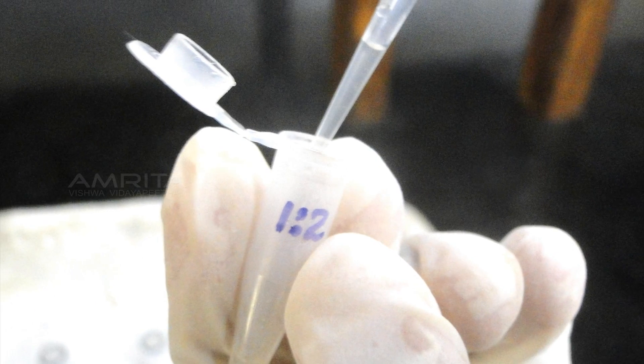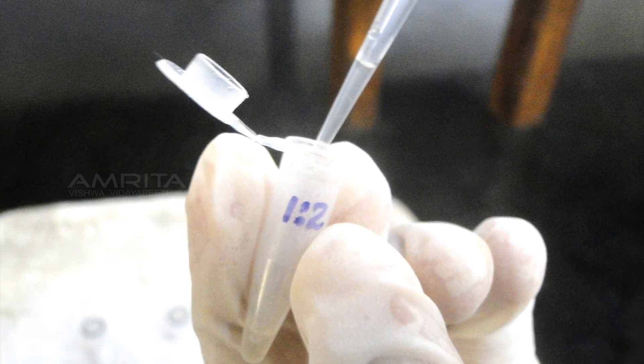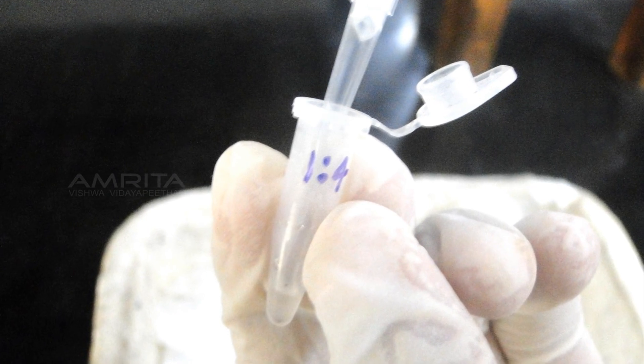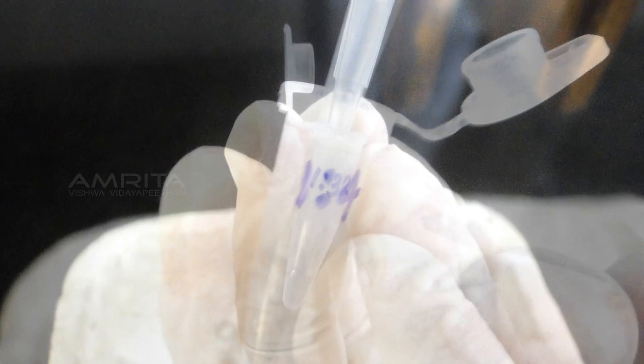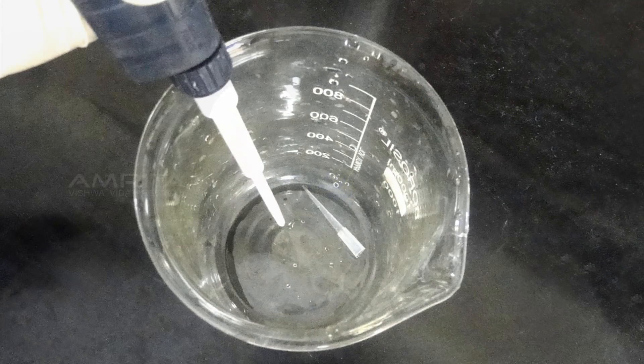Transfer 20 μL of 1:2 diluted antiserum from the first vial into the second vial. The dilution in this vial is 1:4. Repeat the dilutions up to the fifth vial, changing the tip each time.